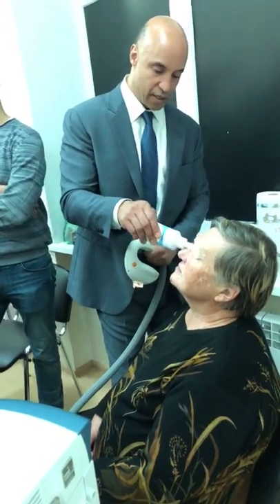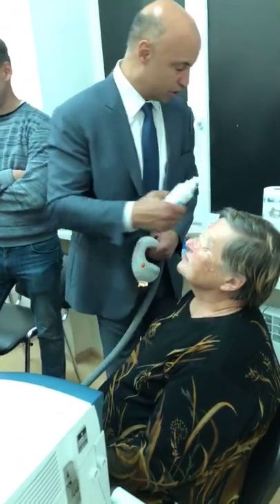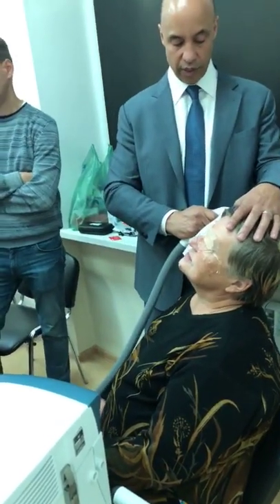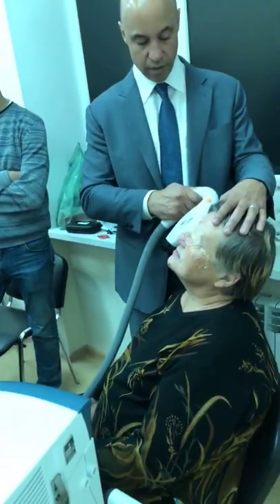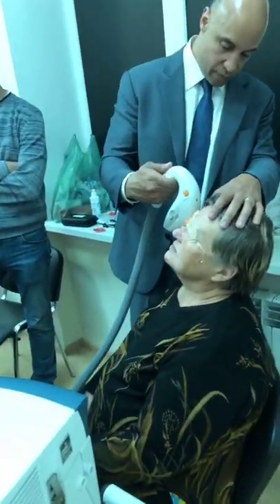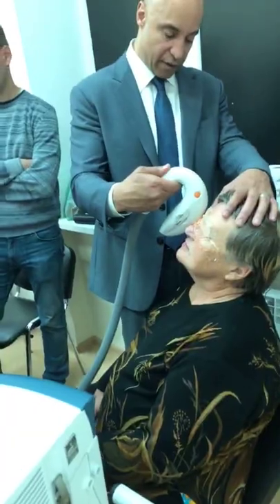What'd she say? She's okay? All right. So you do more gel, and then we go again. The important ones are right there, here at that lid margin.